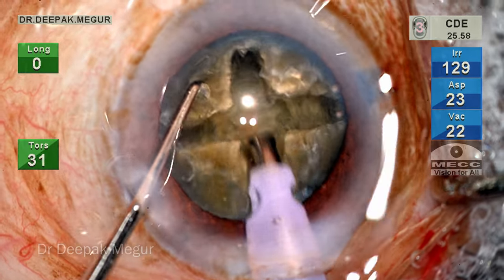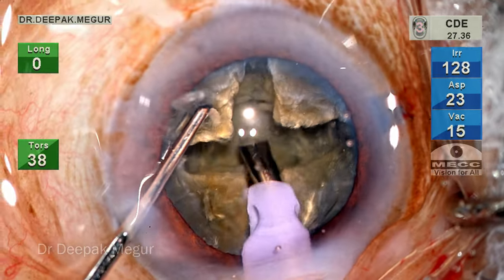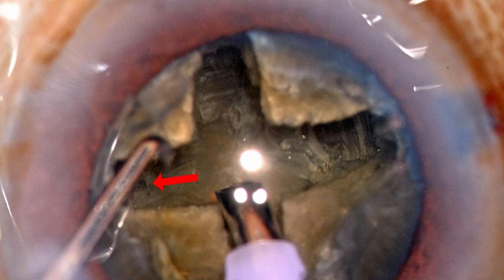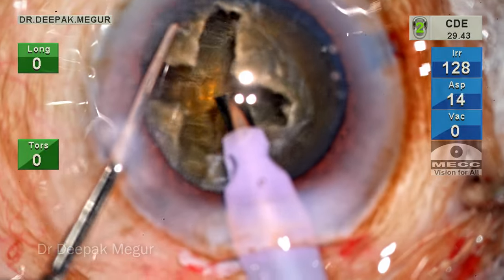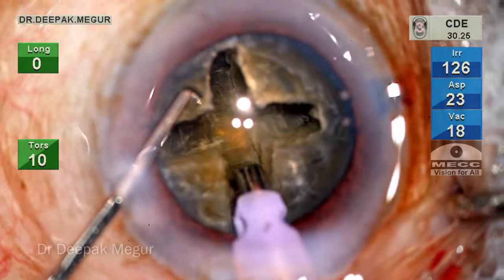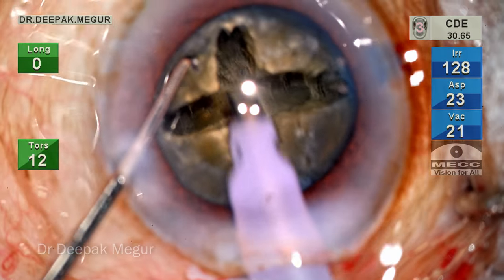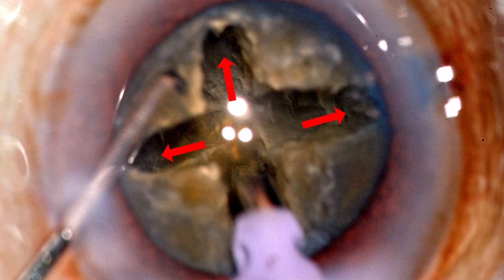I'm going to continue the trenching until there is a change in color of the posterior plate. At this point, the peripheral parts of the trenches have changed to a darker shade and the horizontal striations of the lens fibers are visible but less in intensity. The peripheral part of all the trenches has become much thinner, but the central plate is still quite thick — and this has escaped my attention. The central part is still not deep enough.